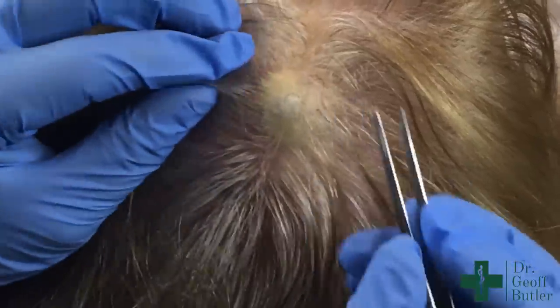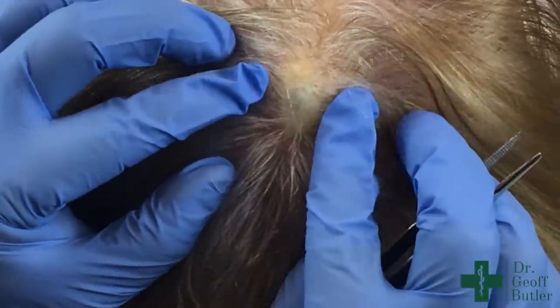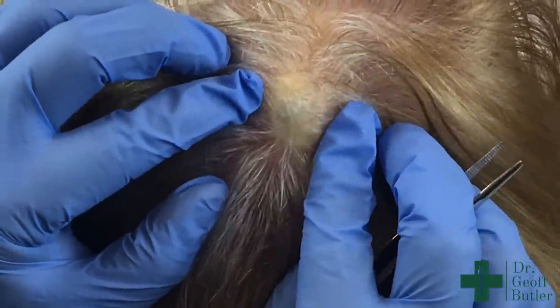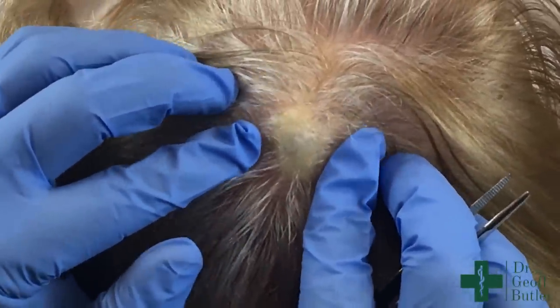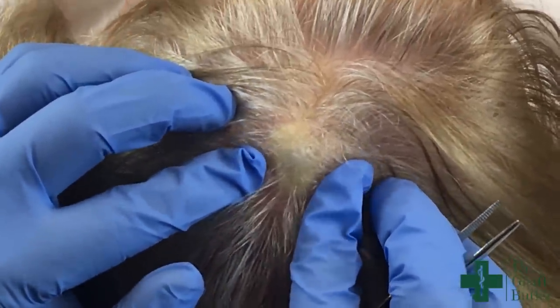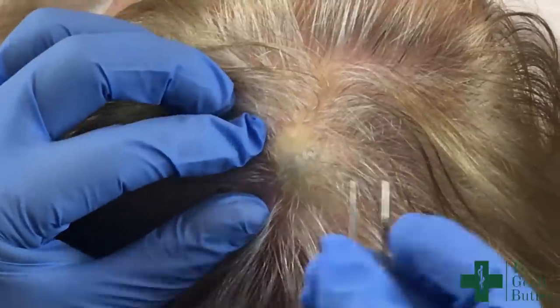This is Catherine. Catherine's presenting today for removal of a lesion that's been on her scalp for a number of years. You can appreciate that this is swollen up through this area.